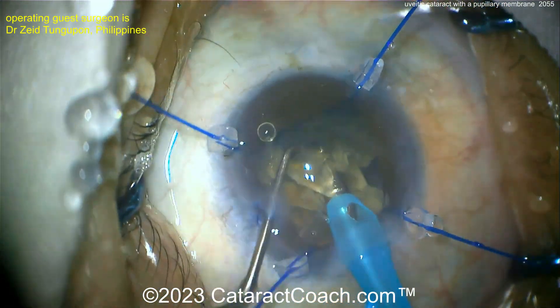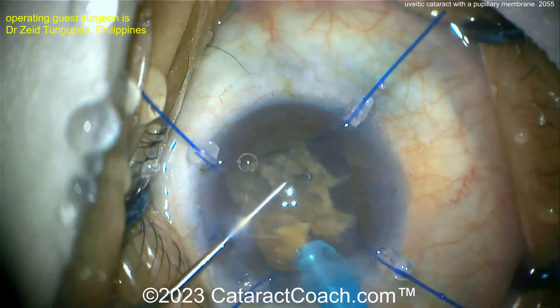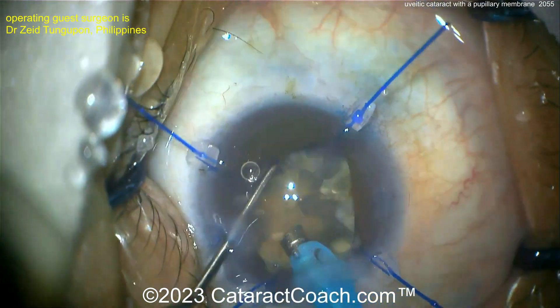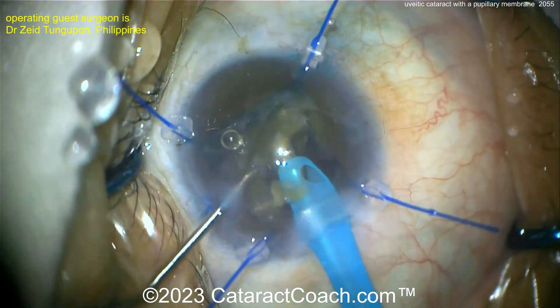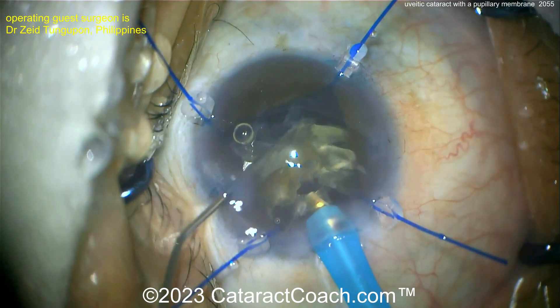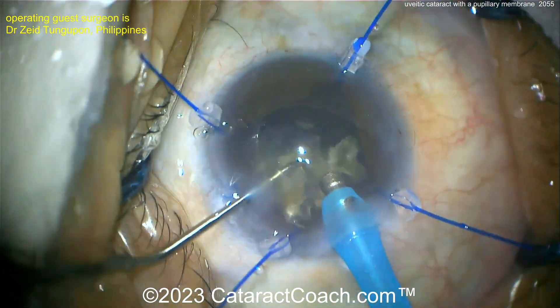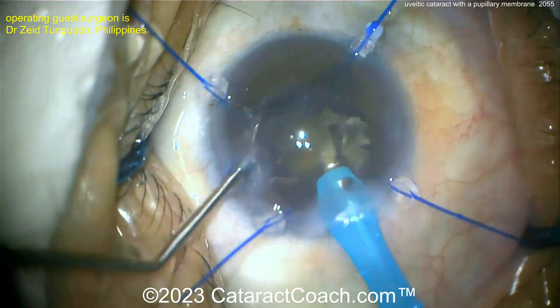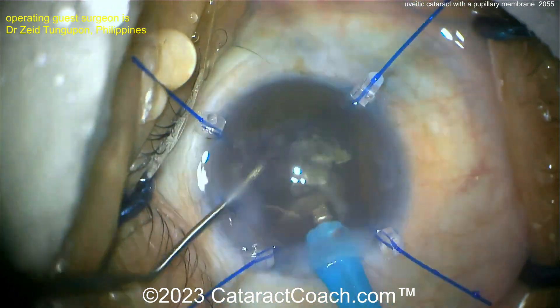At the end of the case, I would put preservative-free triamcinolone in the anterior chamber, possibly in the vitreous cavity, and definitely in the sub-Tenon space — in addition to the topical steroids you'll give the patient post-op. Making good progress on the nucleus; the key is taking your time — chop, chop, and more chop. Notice the surgeon is doing re-coats of viscoelastic to protect the endothelium, and some viscoelastic was injected behind the nucleus to keep the posterior capsule away from the phaco tip. Very smart.